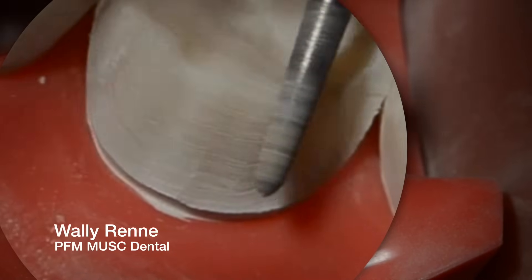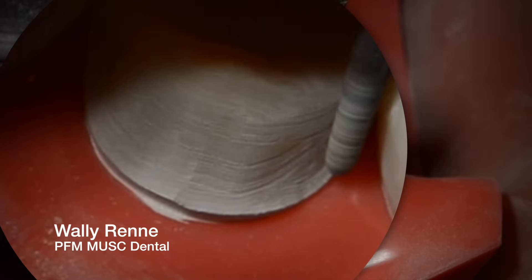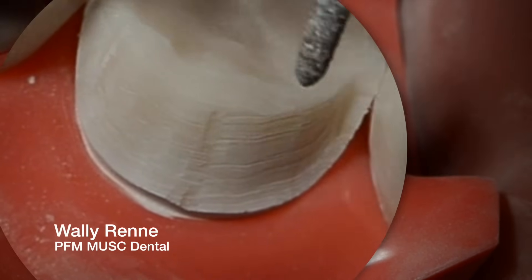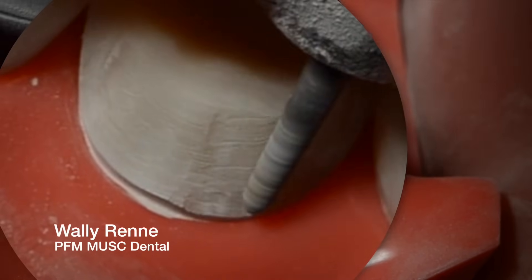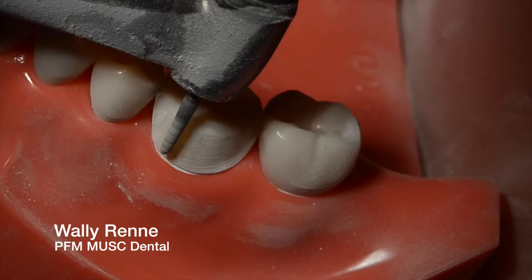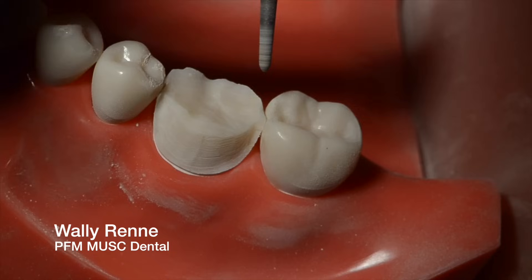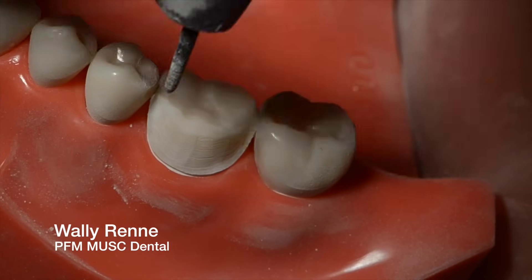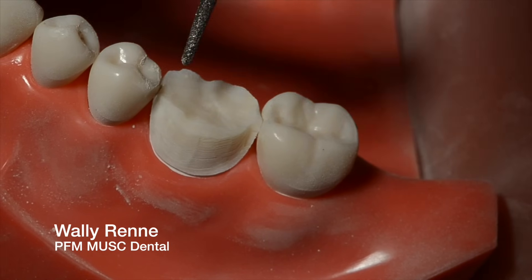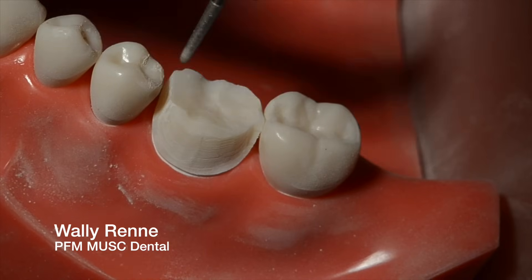By doing this little functional cusp bevel right there at about a 45-degree angle, I'm just ensuring that later on I can keep that in my preparation. Now I'm just fine-tuning that finish line again. The next step is going to be interproximal reduction. I'm going to switch to 016 here because it's a little scary to take the 018 through, even though you could, because you need a heavy finish line all the way through.